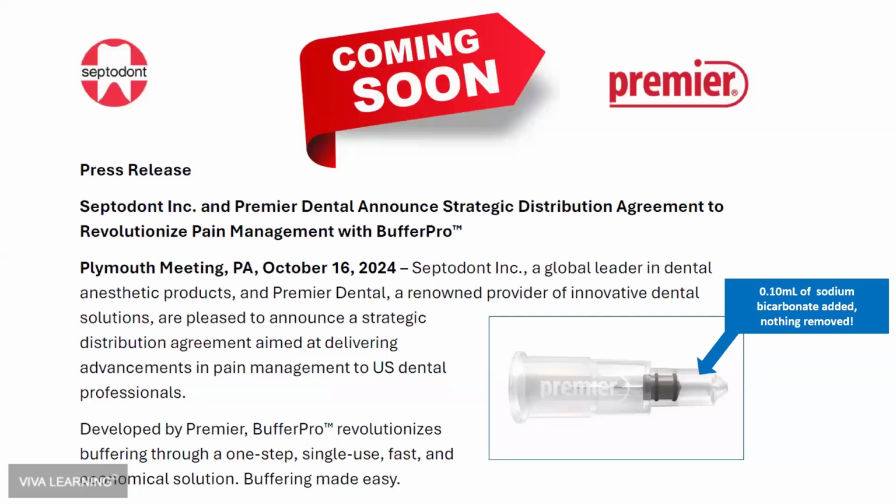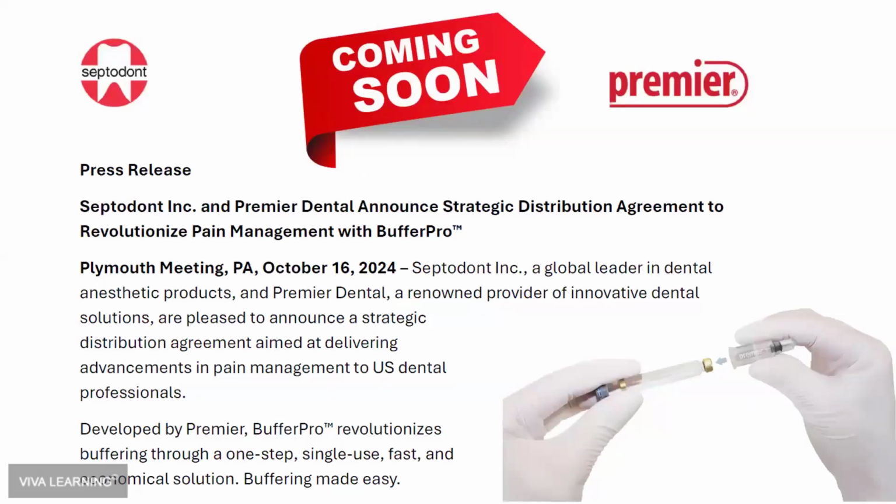So this was the press release back in October. Again, this was teasing the idea of a new sodium bicarbonate delivery system to buffer local anesthetic cartridges, and it was going to be called Buffer Pro. It was going to deliver 0.1 mLs of sodium bicarbonate via the direct injection technique that I just showed you. And how was that going to work? Well, it was these little capsules that all you needed to do was push together essentially to deliver the 0.1 mLs into the local anesthetic cartridge. You did not need to remove anything. So you still were able to deliver the same amount of local anesthetic, just adding that 0.1 mLs.